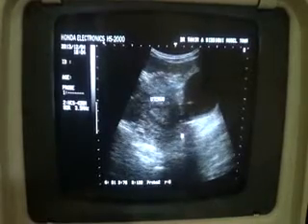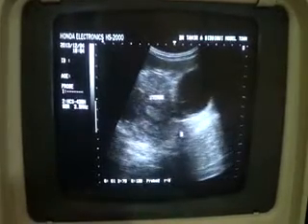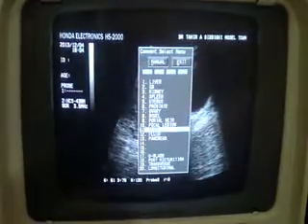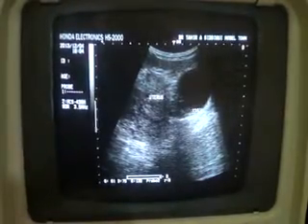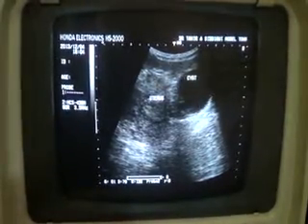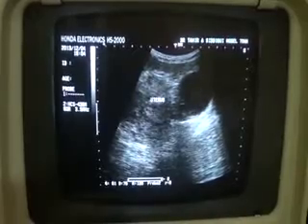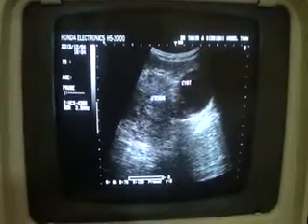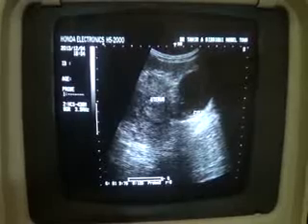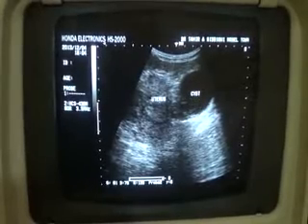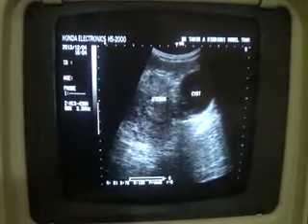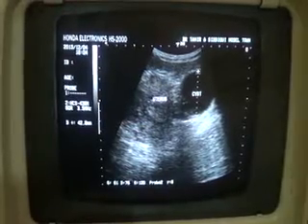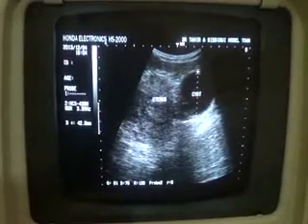I am moving the probe transversely to show the uterus in transverse section. In transverse section, we see a cyst — internally clear of any septa, debris, echoes, or calcification — with posterior wall enhancement seen in the region of the left adnexa, measuring approximately 4.2 by 4.2 centimeters.